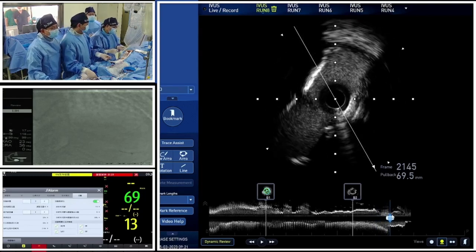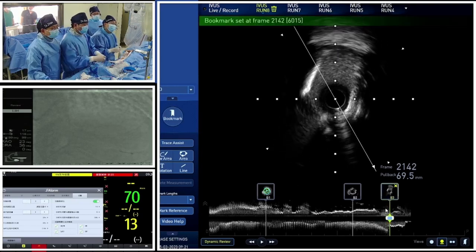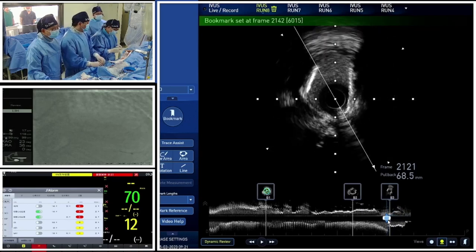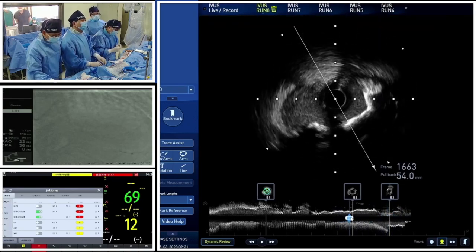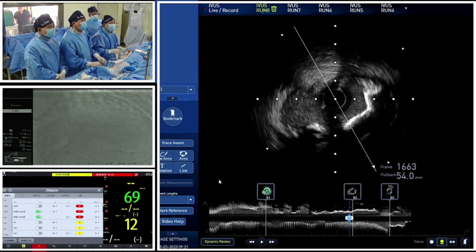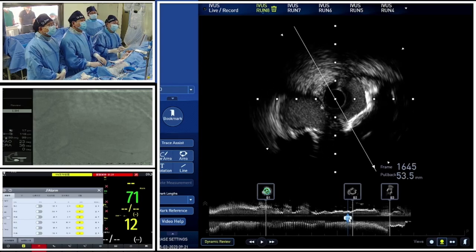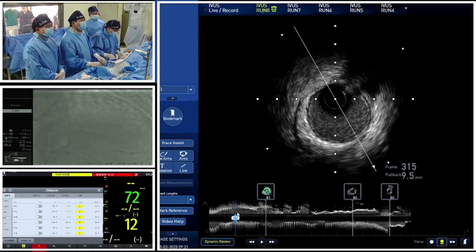Yeah, you're right. Whether or not the fistula has an impact on the functional assessment depends on the location of the fistula and also where it joins to, right? So right now, I think Dr. Gong has run the IVUS in the LAD, right? Yes, we just combined. Can you take us through the IVUS? Okay. Dr. Zhang, can you show us the IVUS result?